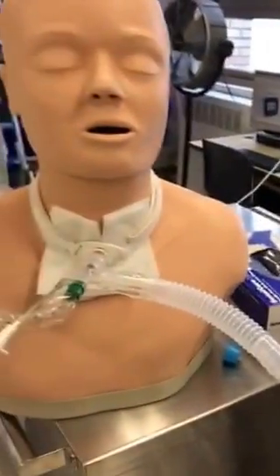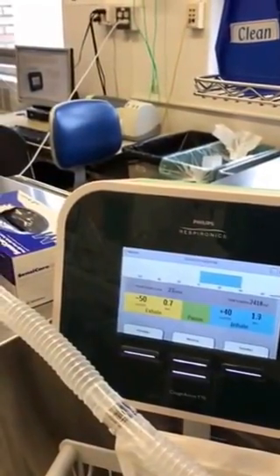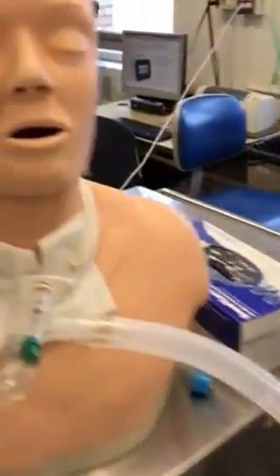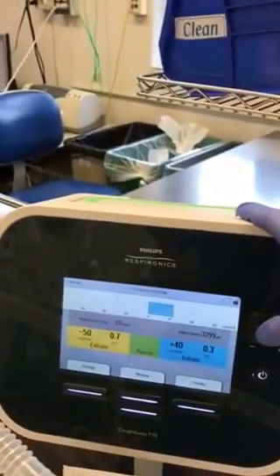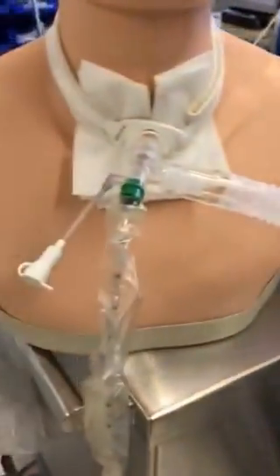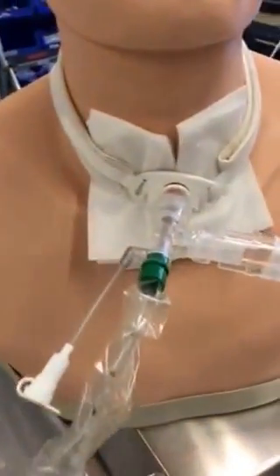So you're gonna do in, 2, 3, out, 2, 3, in, 2, 3, out, 2, 3. And when you give them that breath, make sure you have your suction ready at the tip of the trach. Then you do in, 2, 3, flip to cough, and while that happens, hit your suction and hit the exhale. Cough, cough, cough, cough, cough. And then usually secretions would come up to the trach.